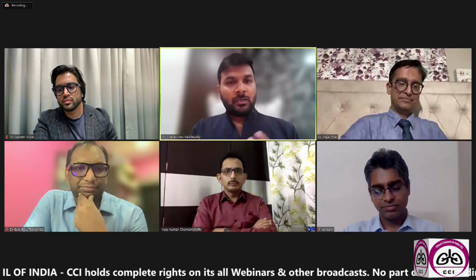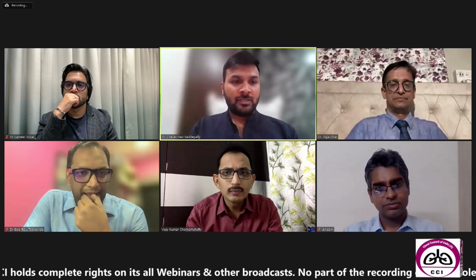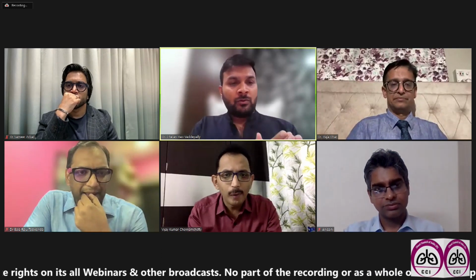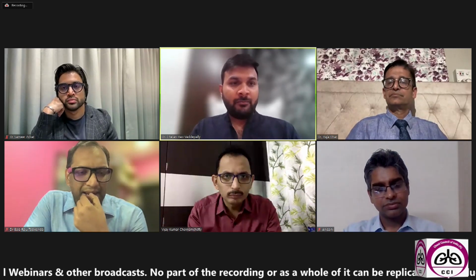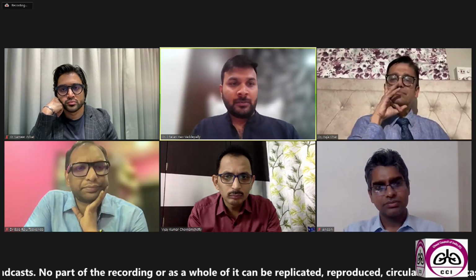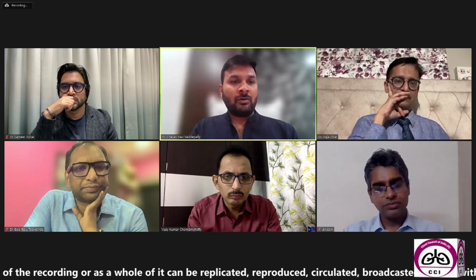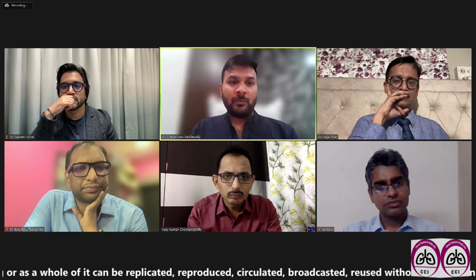Yeah, sir. So at least 80% of the times you get your diagnosis with your conventional EBUS TBNA. So the exact role of cryo nodal biopsy is not yet identified, but just like the article we published, we proposed an algorithm where we do a rapid on-site evaluation with a trained pulmonary cytopathologist. And if she feels the material is either non-diagnostic or inadequate, that is when we pitch in and do a cryonodal biopsy.